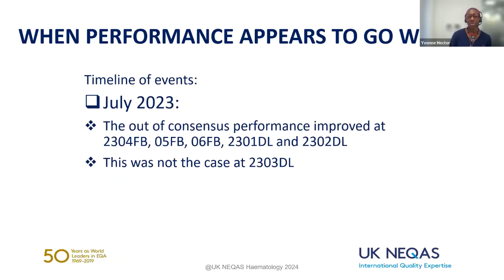At that time, Horiba mentioned that there were still sites that had upgraded software from version 2.1.0 to version 2.2.2, but these sites had not been instructed to run the samples as we had asked. So they had been running samples using version 2.2.2 as they had previously run them using version 2.1.0.